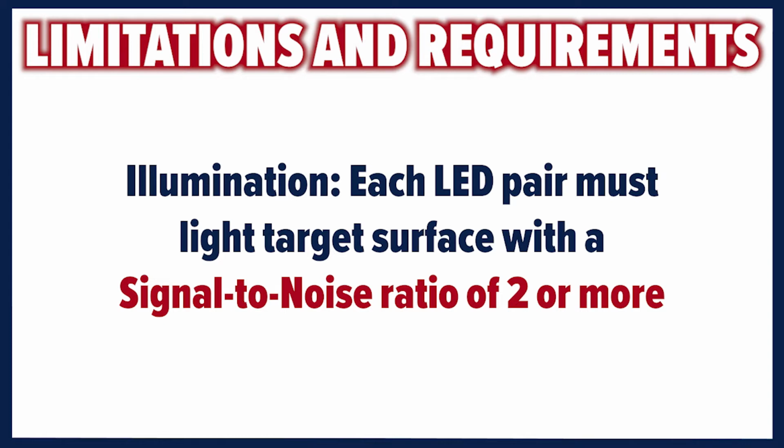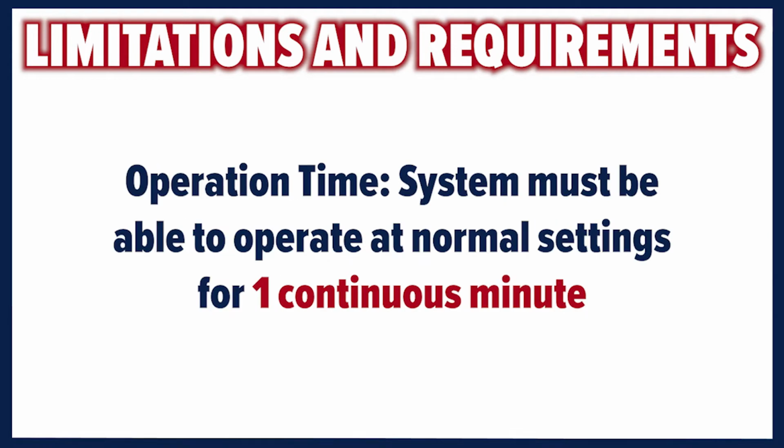Also, the system must be able to operate for up to 1 continuous minute without compromising the structural integrity of the 3D printed casing, overheating the electronic components past their optimal operating temperature, or overloading the image-gathering computer. The system must also turn itself off automatically after 1 continuous minute of image acquisition.